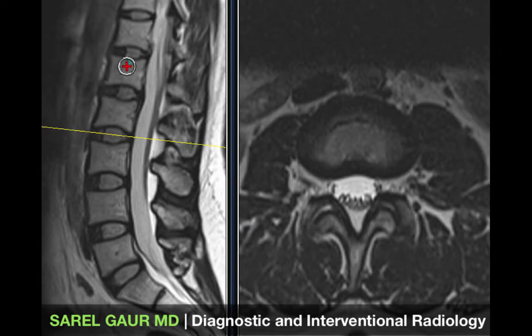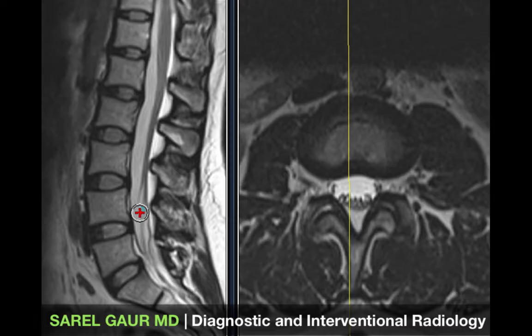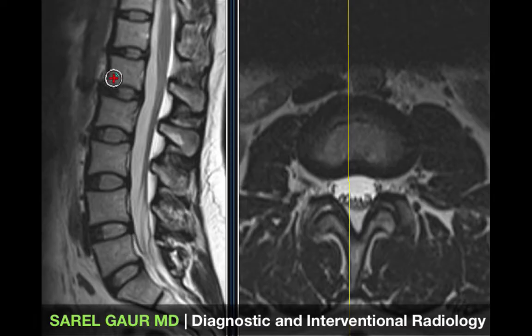I can see high signal surrounding the central canal region and high signal in the fat. I like to start with the sagittal set of images and go from front to back.